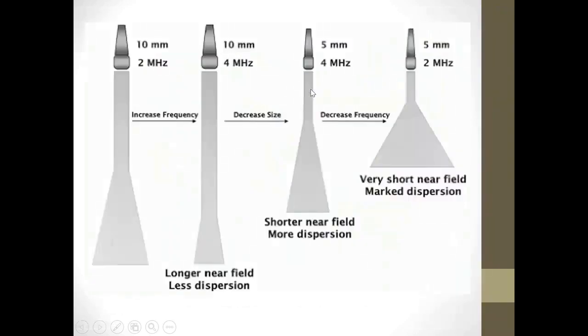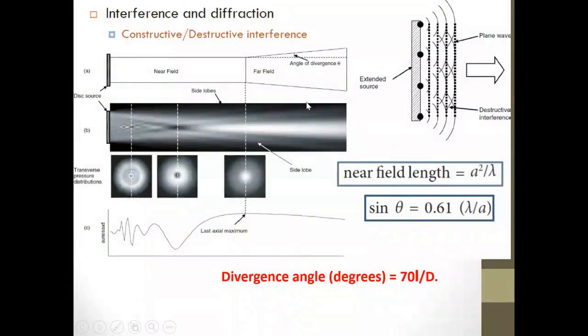We talked about the idea of the beam shape that comes out, and the implications of it, of course. We thoroughly discussed it last time, and why I have the area that is particularly relevant to me, because this is the area where what happens is called the near field. There is a certain distance before and after this area, and this distance is where it is highest for me in detail to my work.